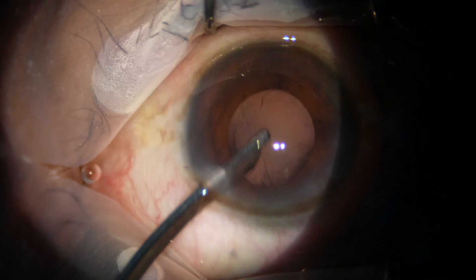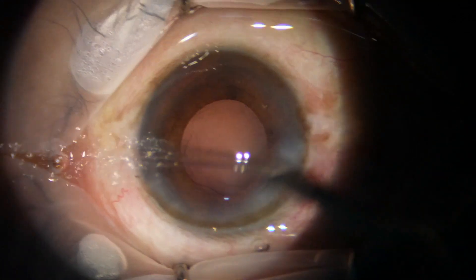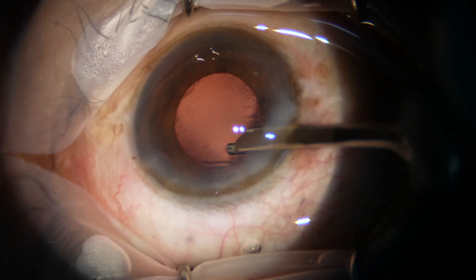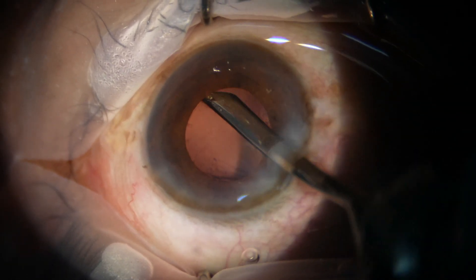I can't see the cortex when I try to remove it with the coaxial irrigation aspiration. Now I go through the side port and remove the sub-main incisional cortex with the Simcoe. And all the cortex from all around has been removed.